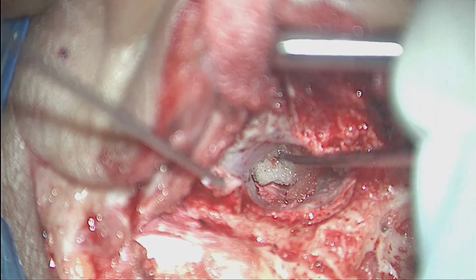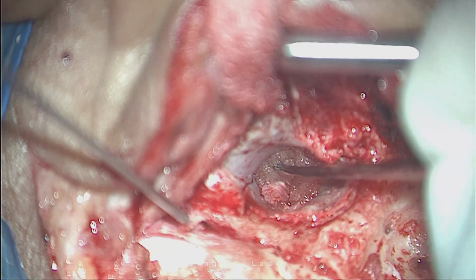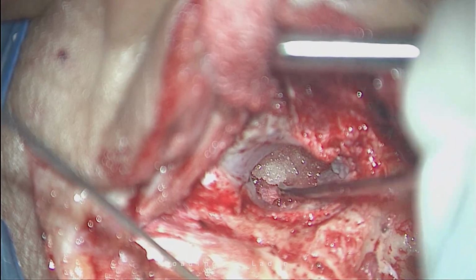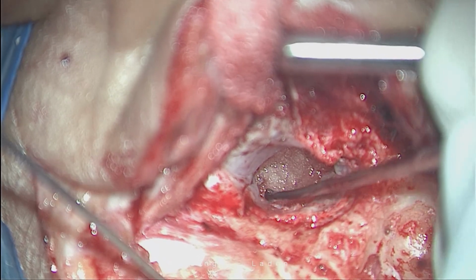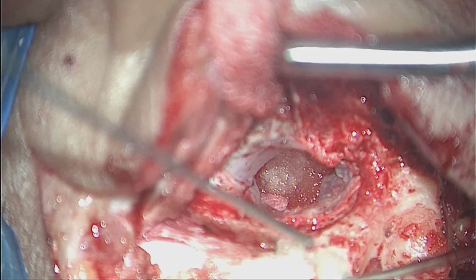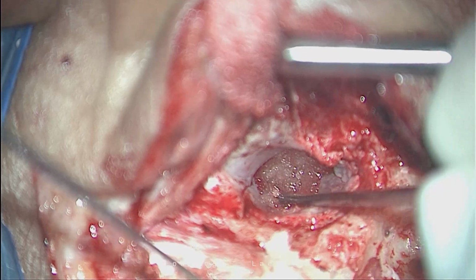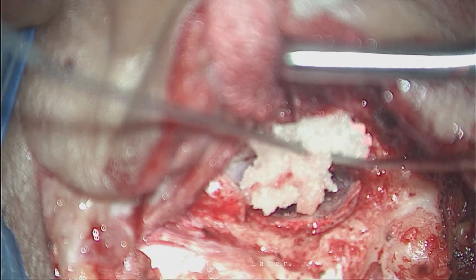Sir, should we soak the gelfoam in blood also? Yes, it automatically gets soaked in the blood in the region. The reason for soaking in the blood is that the blood contains fibrin, to make it more and more adhesive. See this? First on the periphery all around, so my graft remains undisplaced.